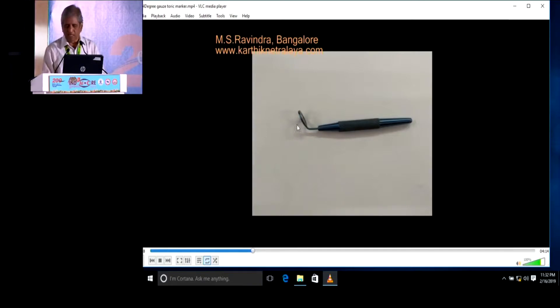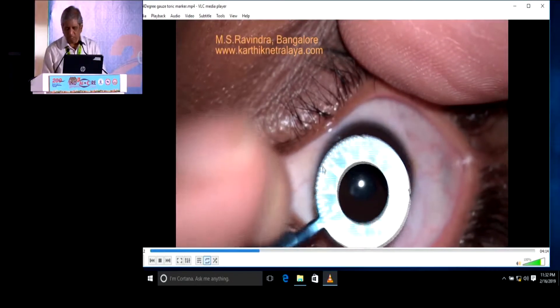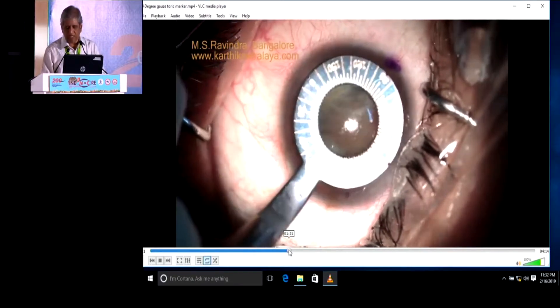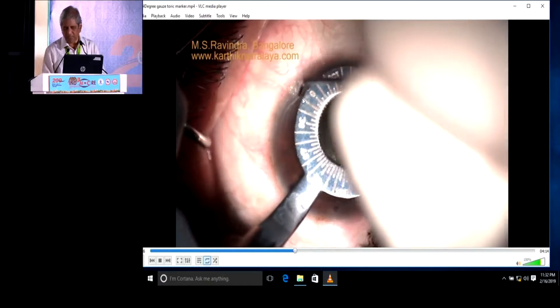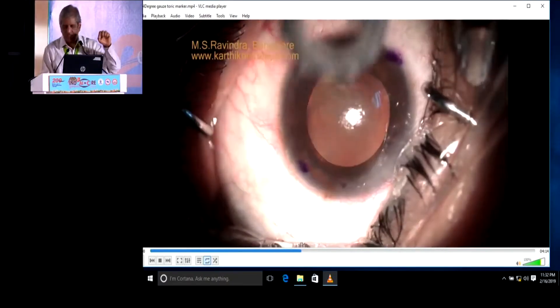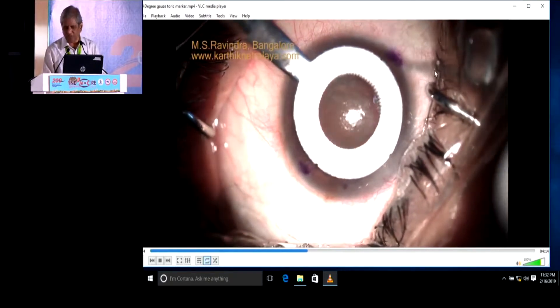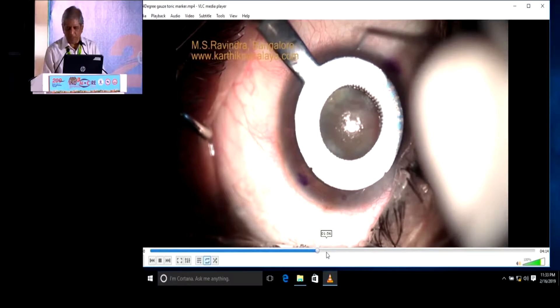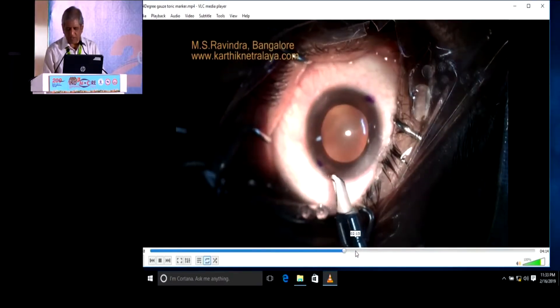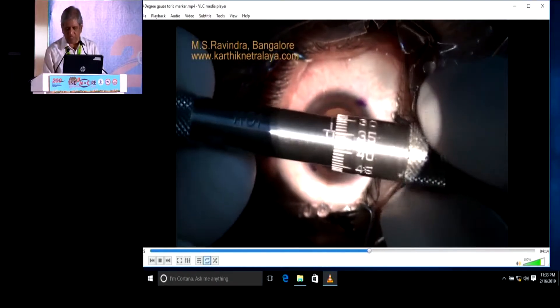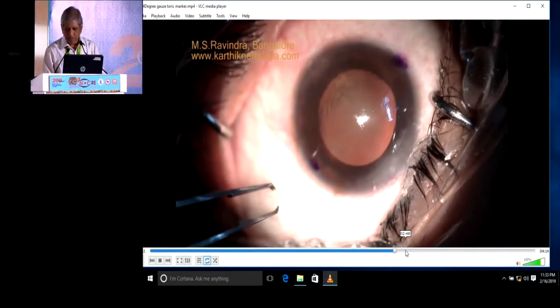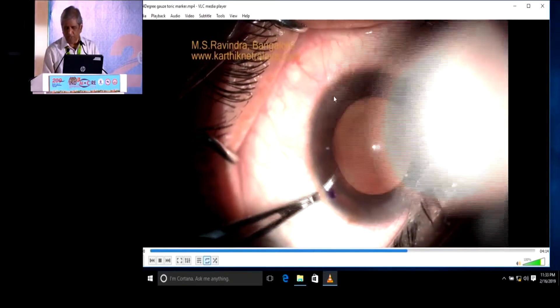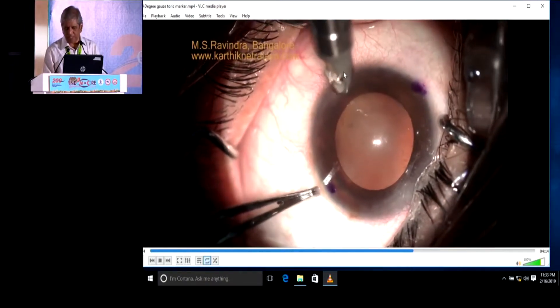The handle is at 30 degrees, not at 0 degrees, so it will spare the horizontal as well as vertical meridians. Along with the cataract surgery, I've done the limbal relaxing incision. The way I point is exactly at 0 degrees — I touch the tip with trypan blue dipped on a 27-gauge cannula. That's a very fine cannula. You can see it makes a mark. So you know exactly what degree you'll have to adjust. And here I'm doing a LRI with a diamond knife.